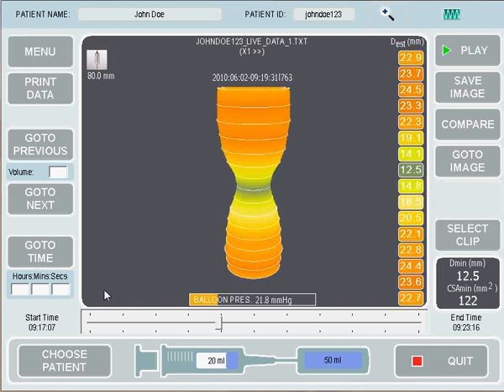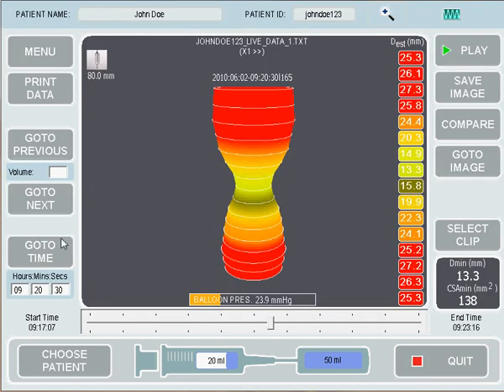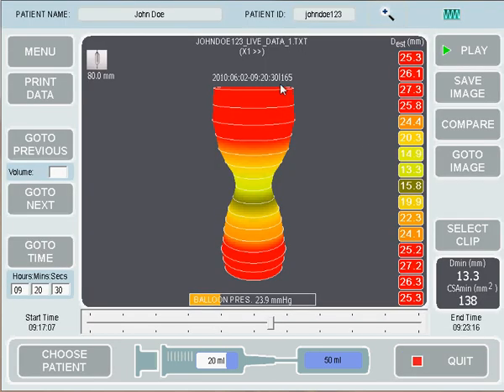If we'd like to go to a specific time, let's say 9:20:30, we enter hours: 9, minutes: 20, and seconds: 30, then press the Go to Time button. You'll see we've now gone to the time 9:20:30.